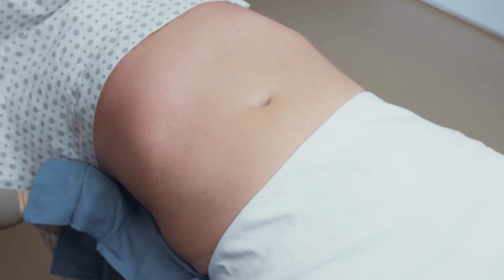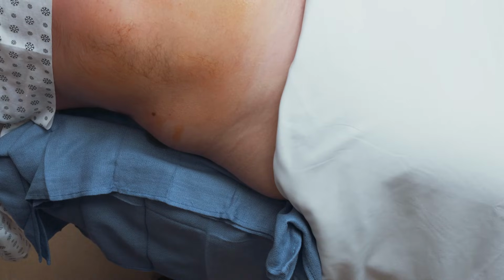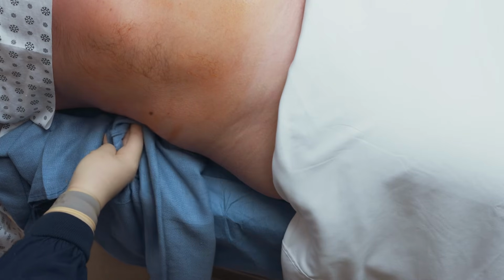Do not allow the solution to pool. Use prep towels to absorb any excess solution. Remove any saturated soaked materials, towels, and gowns from the prep area before draping.